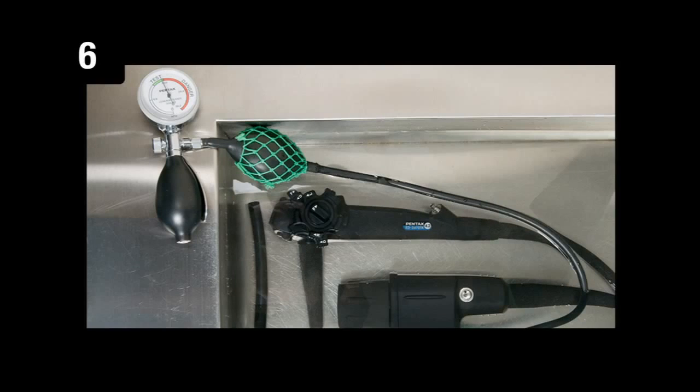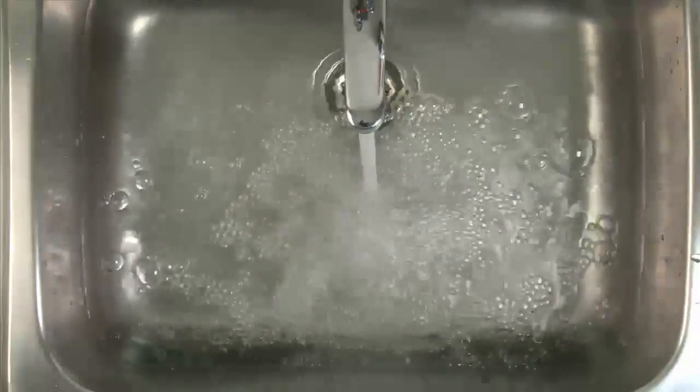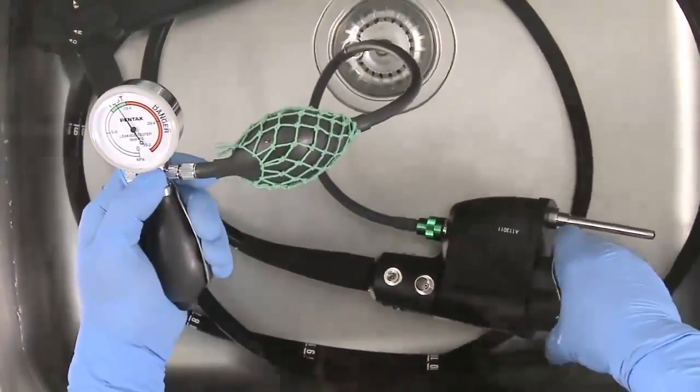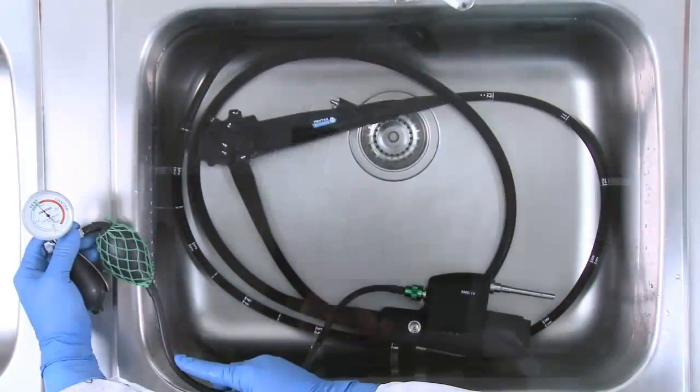Step 6. Perform the wet leak test. Fill the sink with clean room temperature water. With the leakage tester still attached, move the endoscope into the sink and immerse it completely. The leakage tester must be kept out of the water at all times.